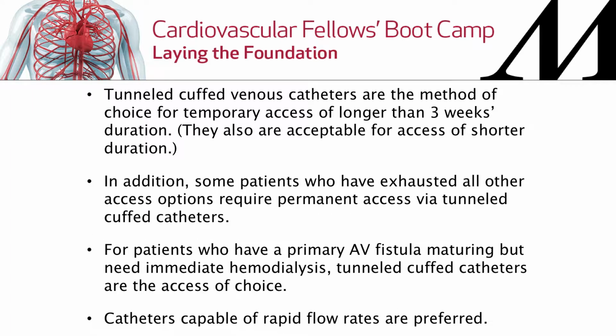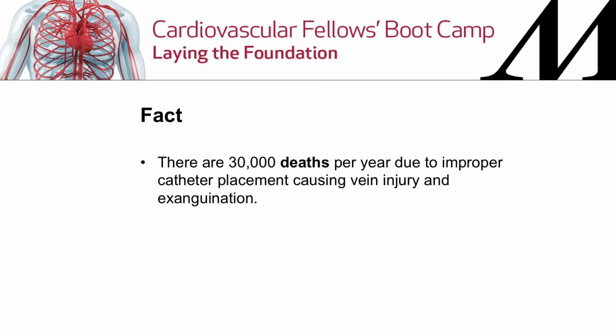And this is a busy slide. You don't have to read it. It comes out of the guidelines. The bottom line is a tunnel catheter is essentially appropriate in most situations. Yes, you can put in a temporary catheter if you're dealing with an acute need for dialysis, but even in those settings, a tunnel catheter is appropriate.